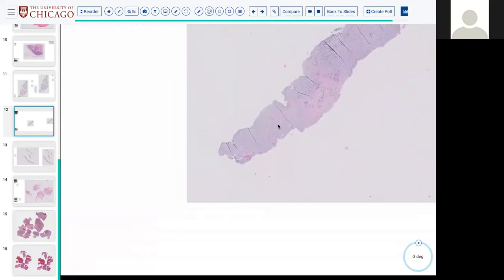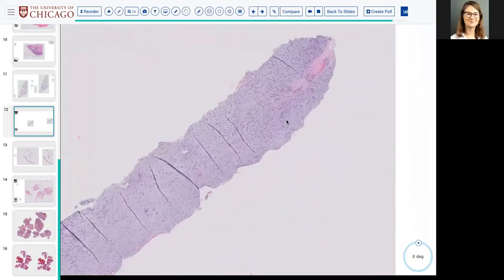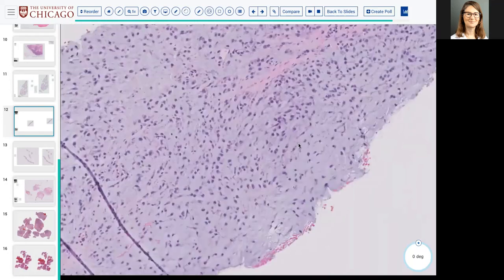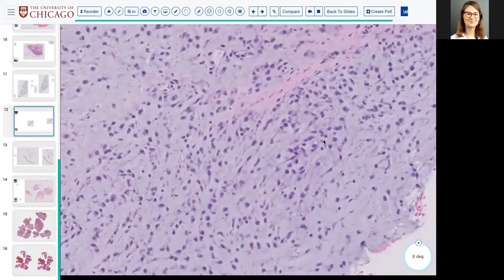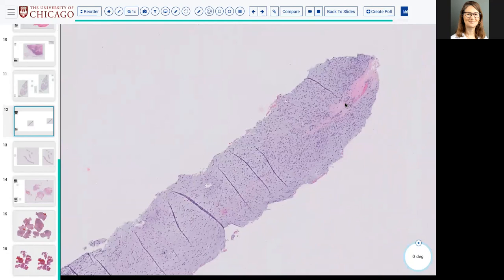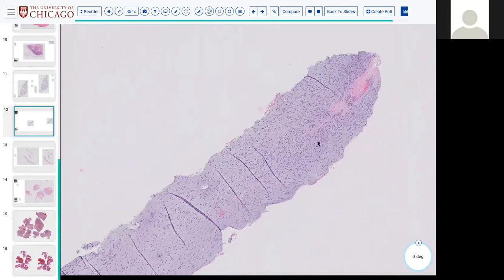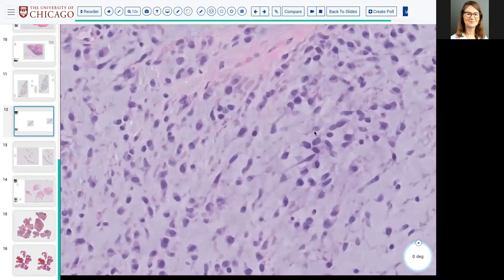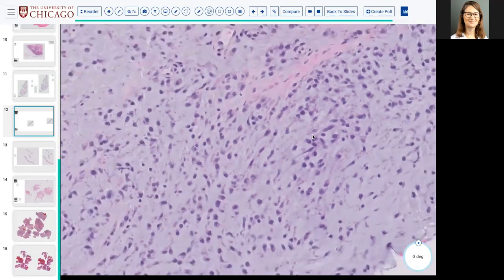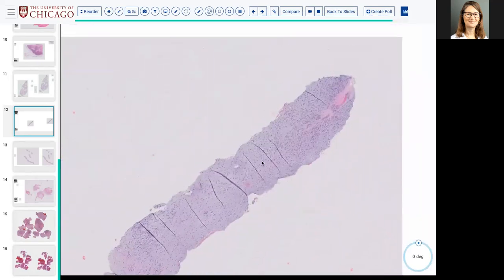Acrofibromyxoma? So like a cellular myxoma? Fibromyxoma. As you said, extremity, I just thought acrofibromyxoma. Yeah, but if it's not in a distal site like finger, palm, nail, in the skin, you're probably not going to be dealing with superficial acrofibromyxoma. If you were in the correct anatomic location, certainly. But this is deep and this is not distal. This is deep and proximal.